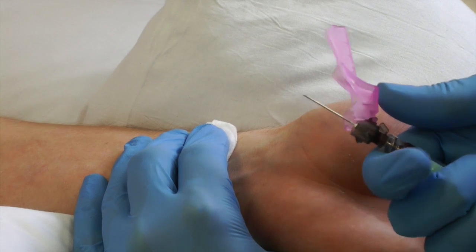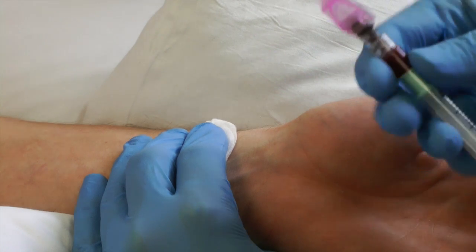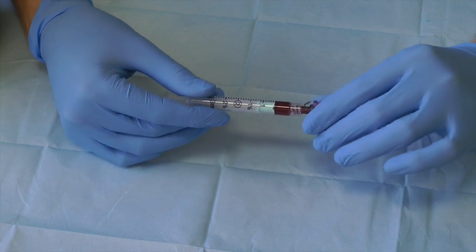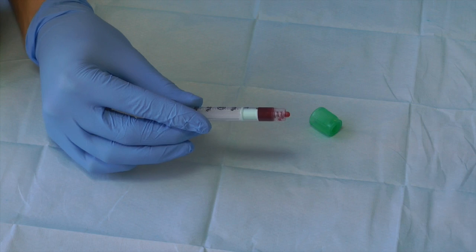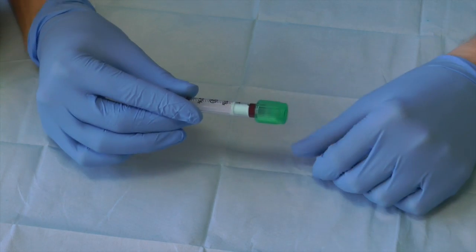Close the needle cover as shown. Remove this unit as one piece and place in the sharps bin. Process your sample at a near patient testing machine, or take it to the lab on ice.